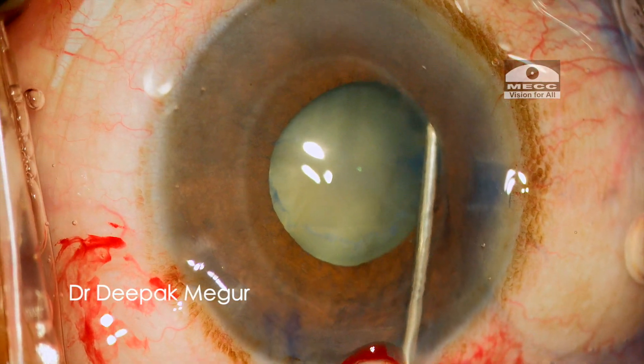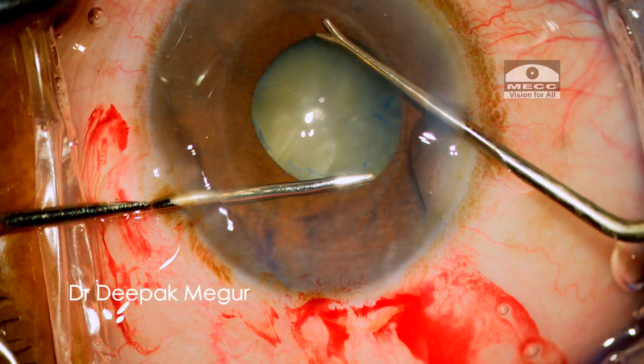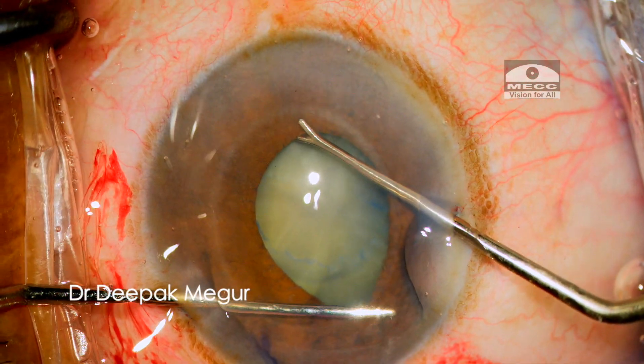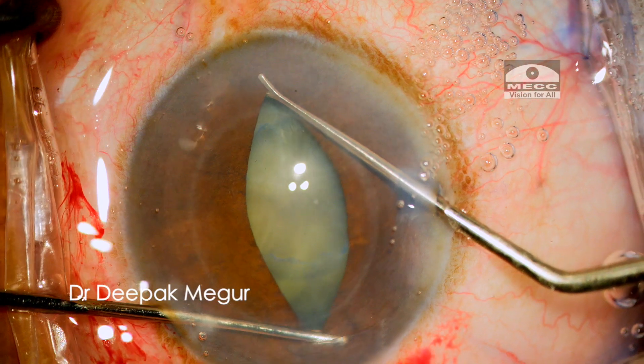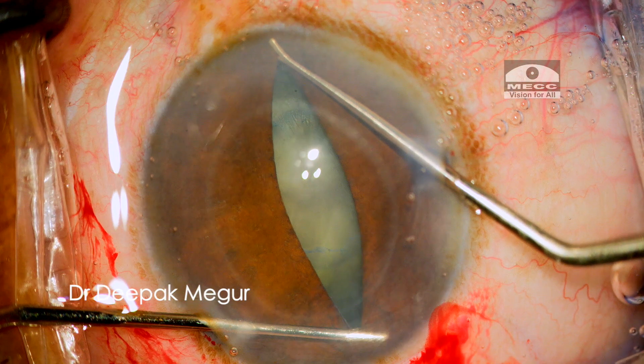When we are dealing with a shallow anterior chamber, as in this case, a good OVD comes in handy. It is critical to stretch the pupil before using the B-hex ring. I use two Y-hooks to do the job, and these Y-hooks are the most ideal set of instruments I have found to perform this manoeuvre.